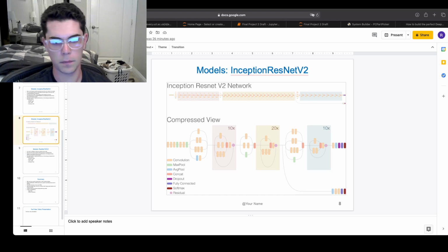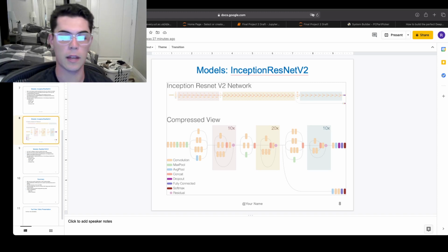So if you want to have a better look at this architecture, I'm already pretty confused by it, but if you really break it down, it's this very deep network of a lot of parameters that were able to get us to our results, because it has such great weights for the image classification task that it was after. Taking off the top of the model and then having it perform a classification task of our own, we were able to create a very strong model right off the bat.